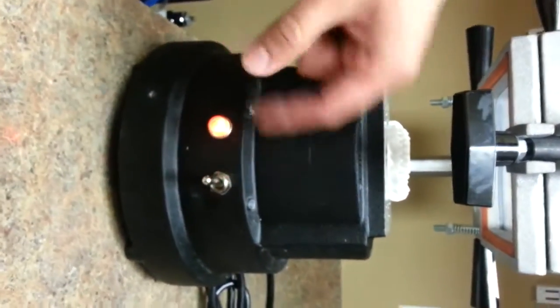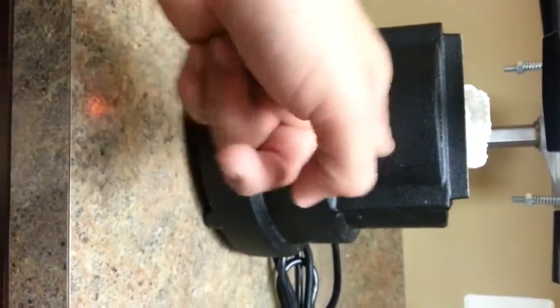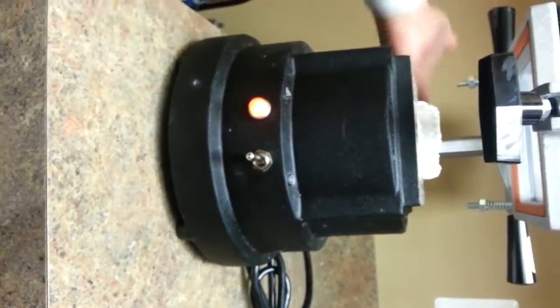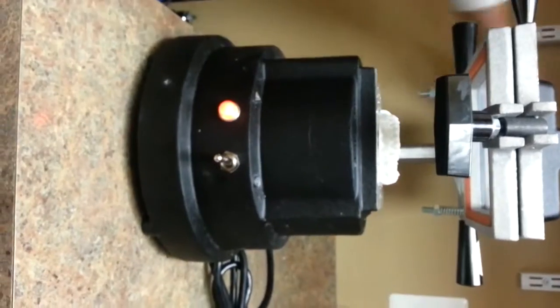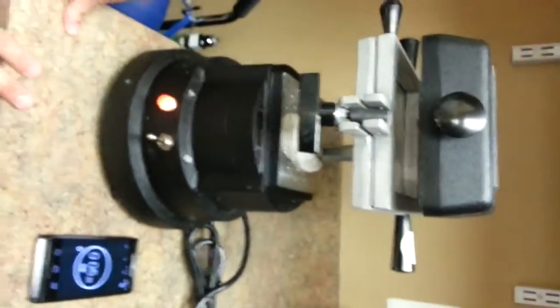Again, this switch, if you turn it to the left, the light's going to come on, the heater's going to be on. Now, there's a neutral, and then there's this. Once you turn it to the right, there's going to be the vacuum. So again, I'll show you how to use the vacuum in just a minute. All right, 30 seconds, that should be it. We'll bring it back up. We're going to start our timer. Again, we're going to put it on the side right there.